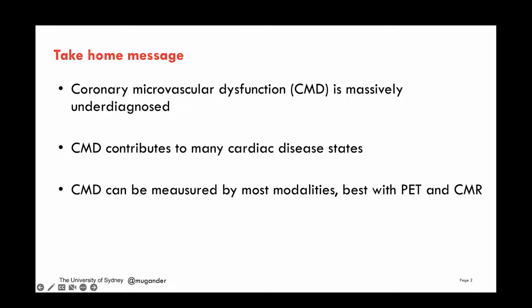The take-home message from this presentation is possibly, there will be methodological aspects that we'll talk about, but coronary microvascular dysfunction is massively underdiagnosed. And it contributes to many cardiac disease states, but we don't know necessarily that it's there if we're not measuring it. But it can be measured by most modalities and probably best with PET and CMR. And we're going to talk about this space now.